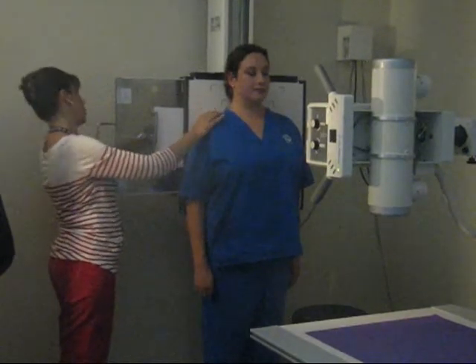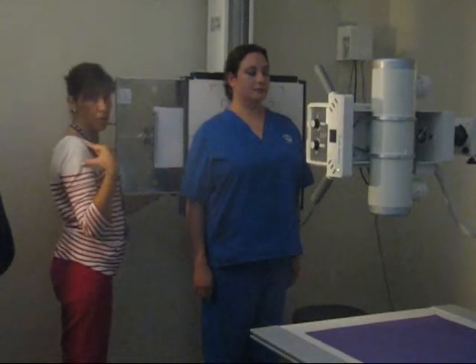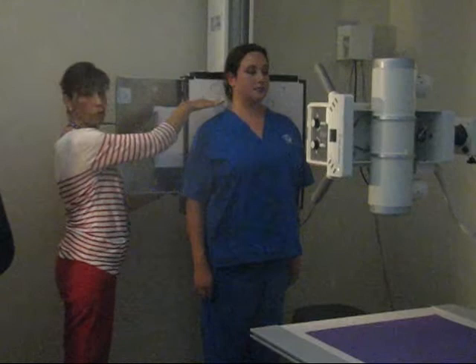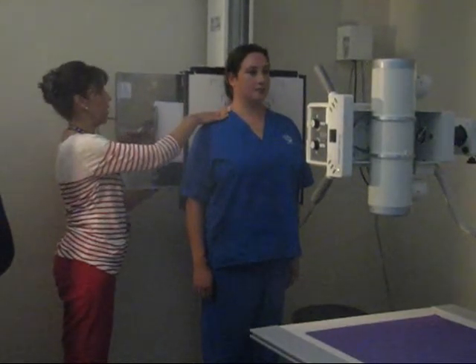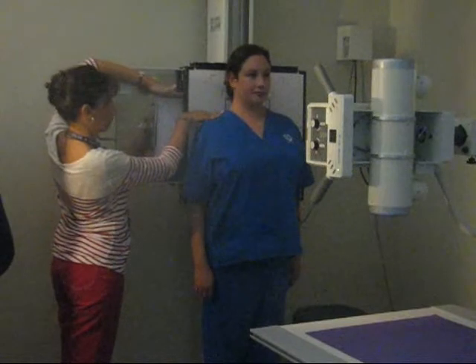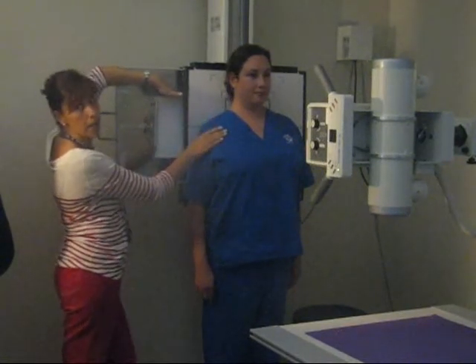about 1 inch, because you're going to have the patient hold their breath. In the case that the patient holds their breath right after inspiration, as you know, with inspiration your shoulder level is going to come up a little, so you want to make sure you don't cut anything out. So about that much, about 1 inch above the shoulder will be okay. 1.5 inches, not going to hurt, as long as you don't cut the body of interest.